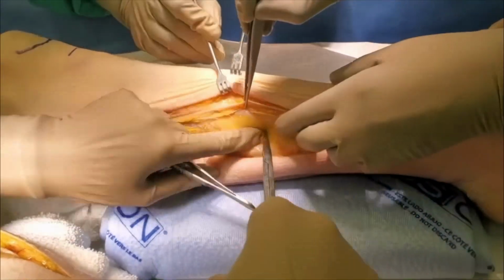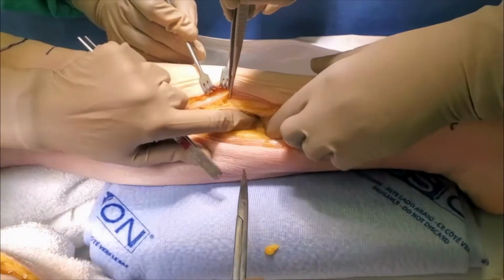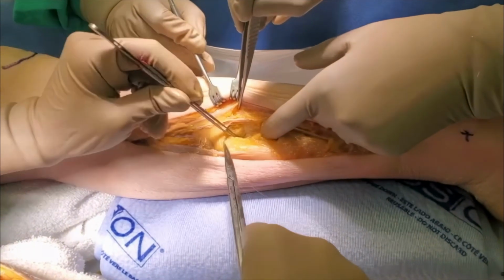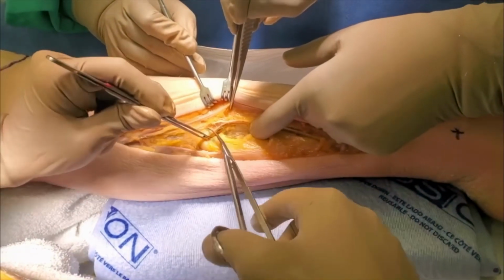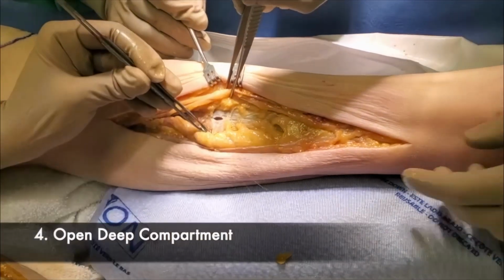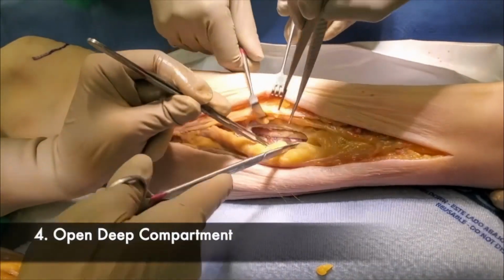To access the deep compartment, mobilize the fibers of the soleus muscle to separate these muscle fibers from the posterior aspect of the tibia. Separating the soleus from the posterior aspect of the tibia will reveal the fascia covering the deep compartment. Cut through the fascia into the deep compartment by sliding your partially opened scissors along the fascia you've uncovered over the length of your skin incision.